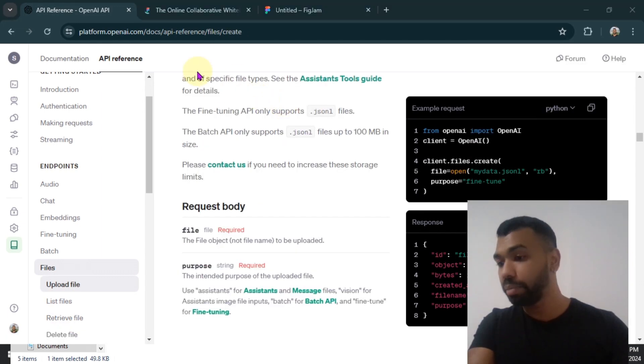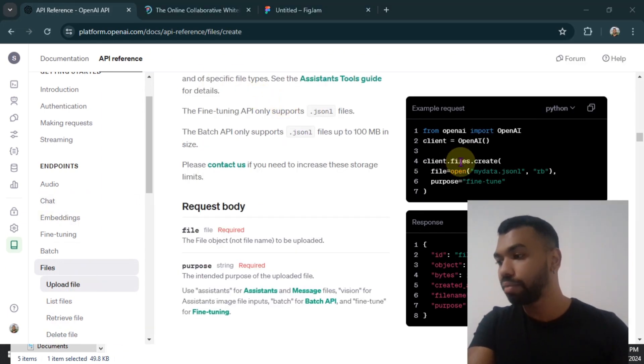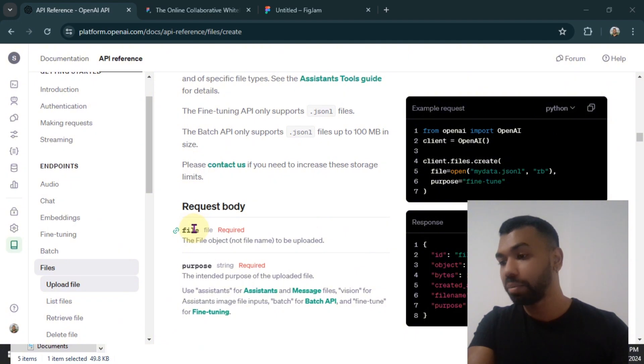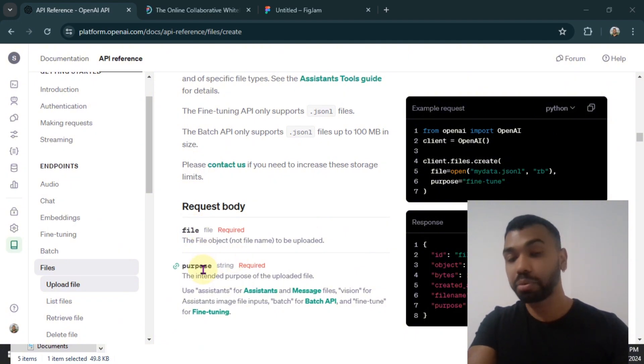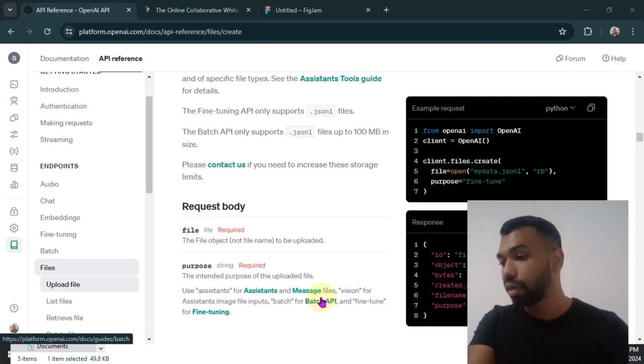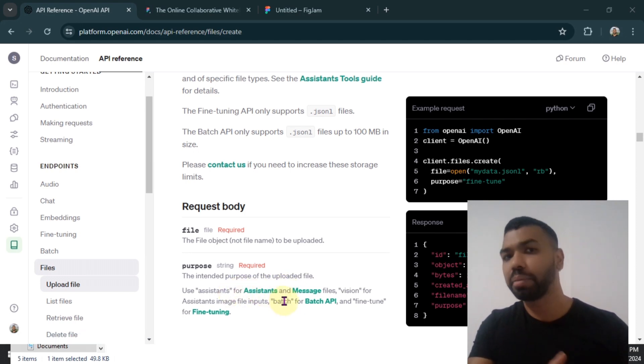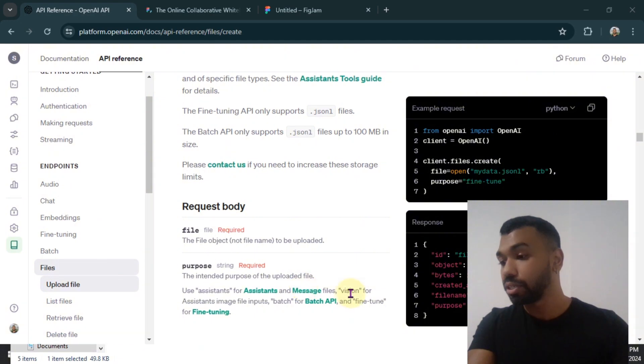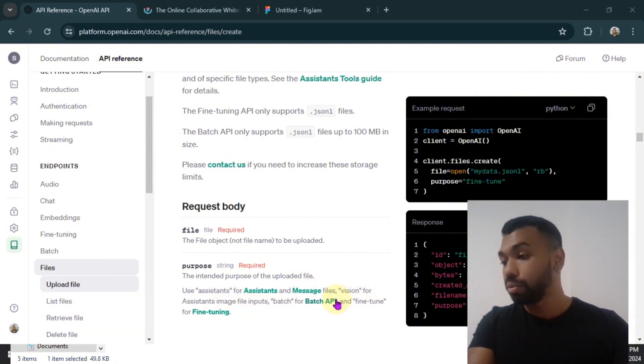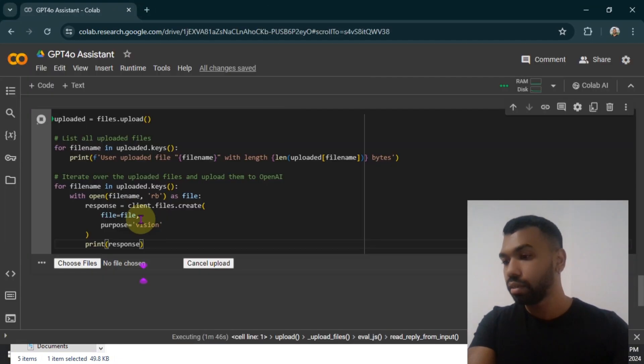If you go back to the API reference under files, you'll notice you have the files.create function. And for that function, parameter is file, the file object, of course, and then you have something called a purpose. And in the purpose, you can use assistance for assistance. And this could be any file like document PDF, something like that. And you can use vision for assistant image inputs. So we're going to use vision.